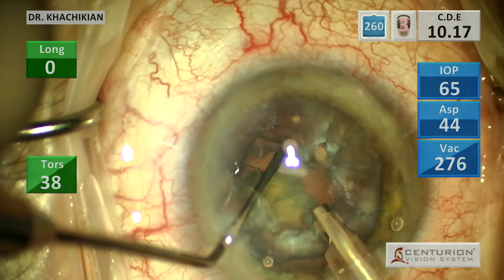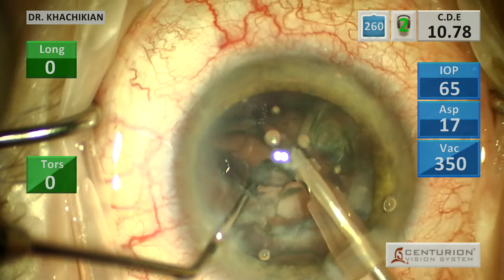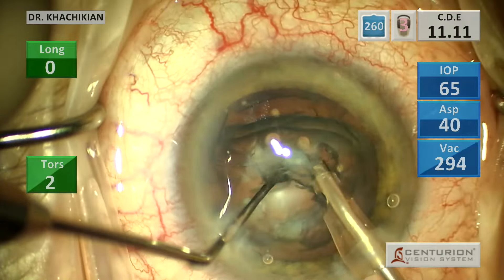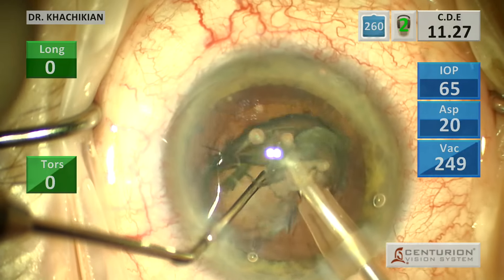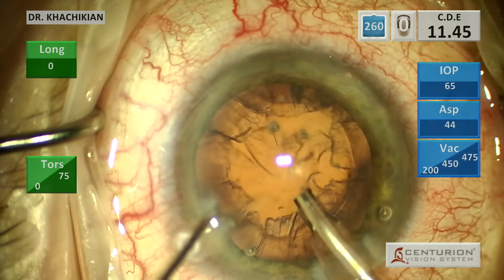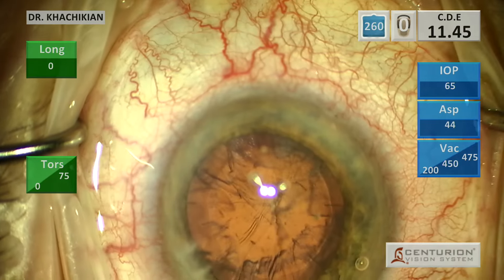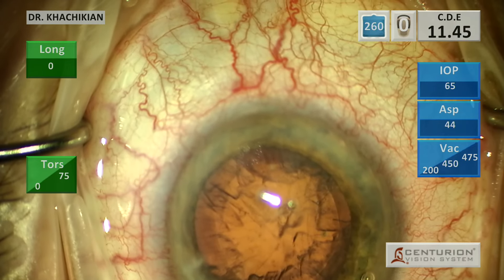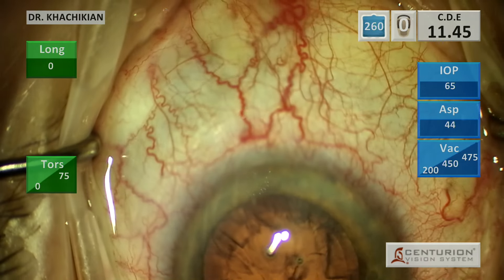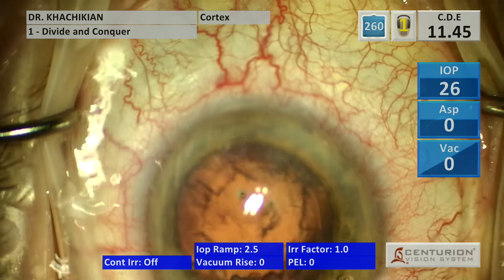Get that last piece out. Phaco stays central, and there we go. Now we'll take out our epinucleus. If you're pointing that phaco handpiece towards the posterior capsule, make sure there's a second instrument there behind it. CDE of 11 — not a soft cataract. I don't think we overused phaco in this situation, although you can always manually dismantle the lens more if you wanted to. Now we'll switch to IA.